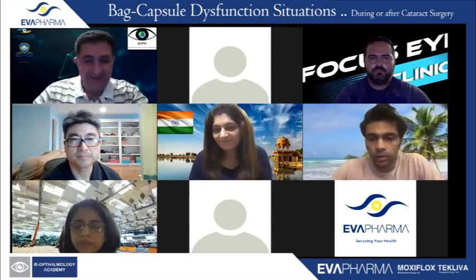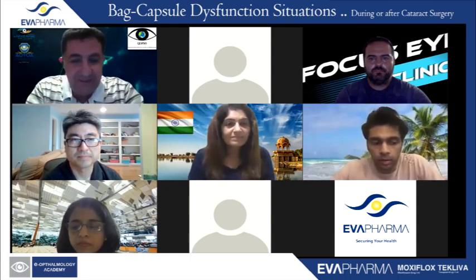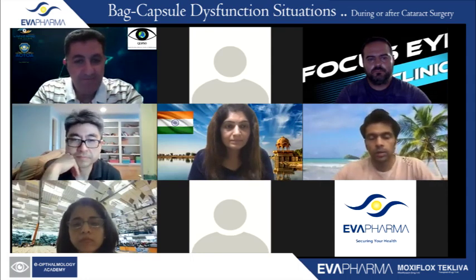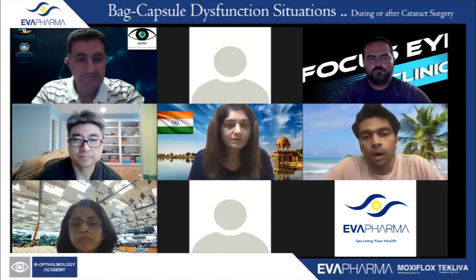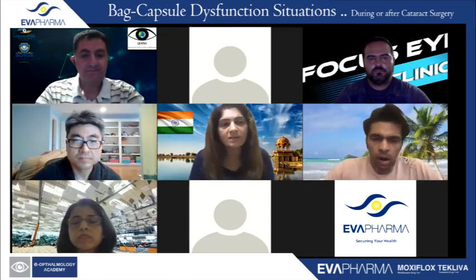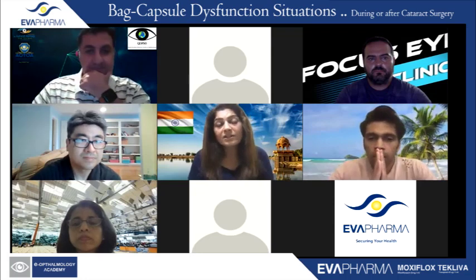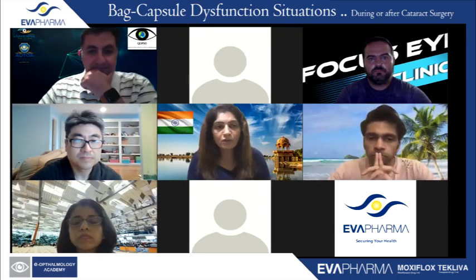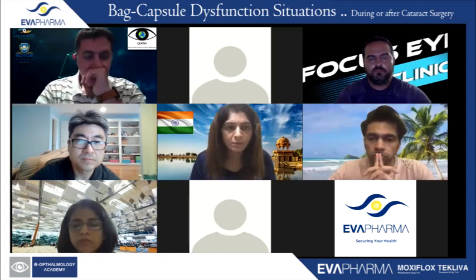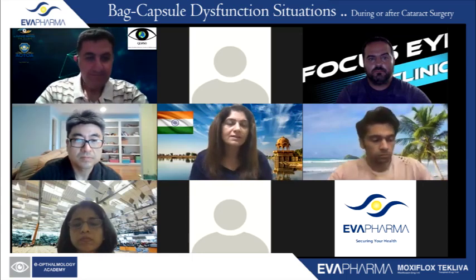Sure. So, how far from the limbus do you do the sclerotomy in a glued IOL technique? Usually it is about 1 to 1.5 millimeter. 1 to 1.5 millimeter is usually the recommended distance. But when an anterior sclerotomy is being done, as I said for larger white to white diameters, we try to come up much more anterior, quite close, maybe 0.5 millimeters or something.